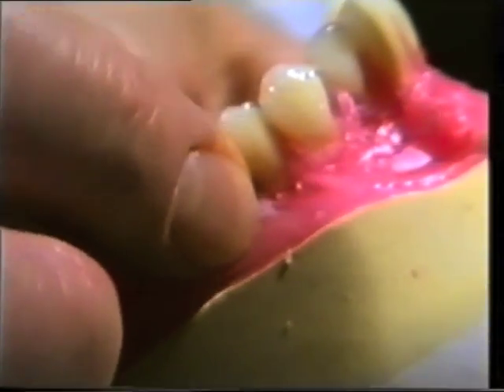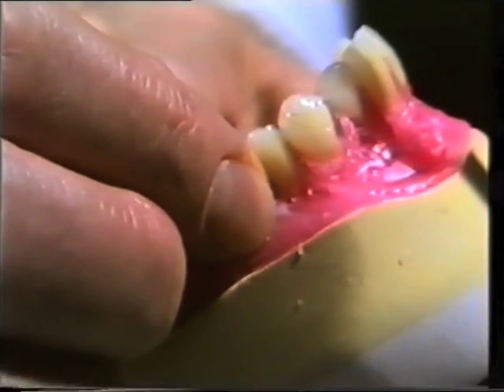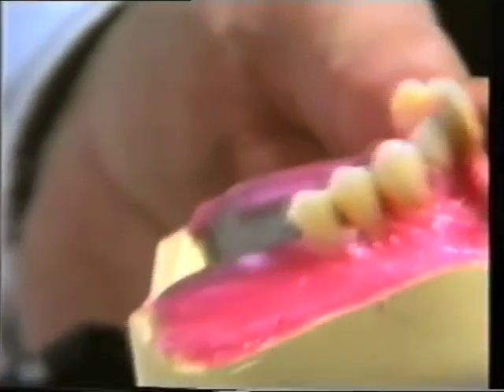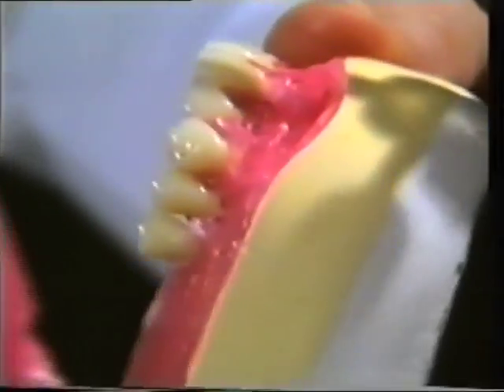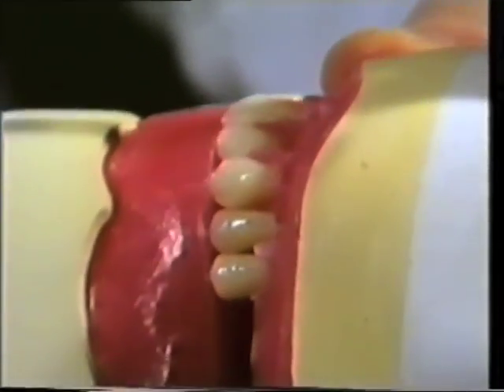The second premolar is positioned so that its long axis is parallel to that of the first premolar. However, both cusps of the tooth must be in contact with the occlusal plane.